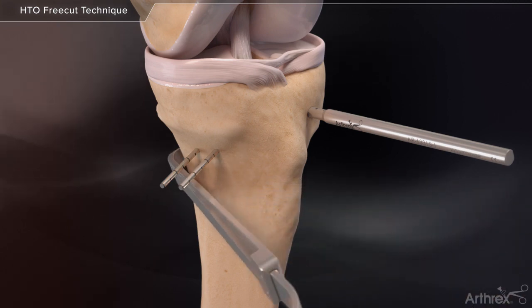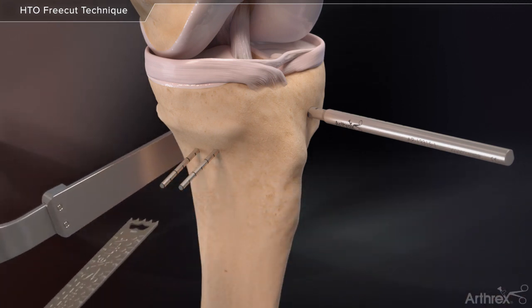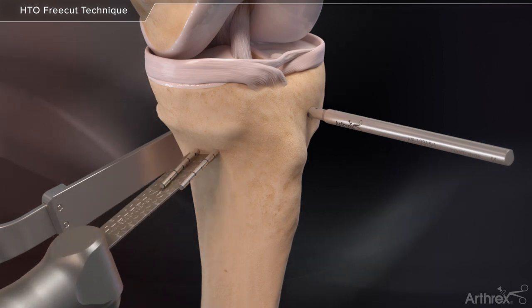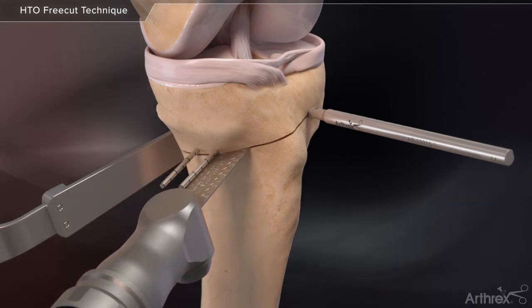Posterior retraction should always be utilized, and the osteotomy can be made in the conventional technique with a combination of sagittal saw and osteotomes.